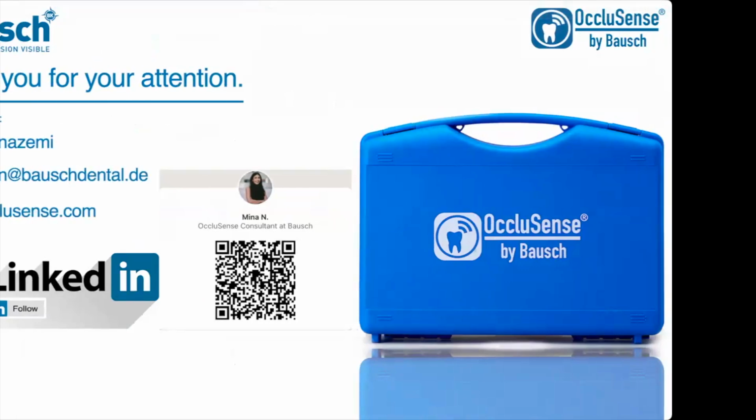Okay, so how many millimeters is the splint in this case? I can't tell you actually because she has an open bite, so the material is differently sized in different areas. It really depends which area you're looking for. And in the example with the Brux checker, it was nocturnal movements that were recorded. So it was a night Brux checker.